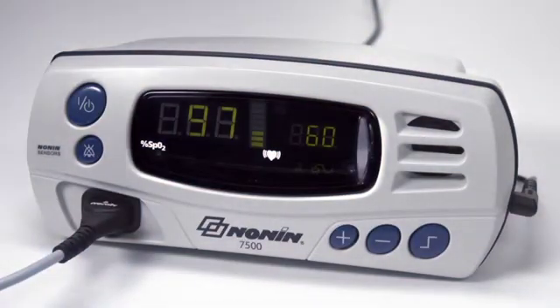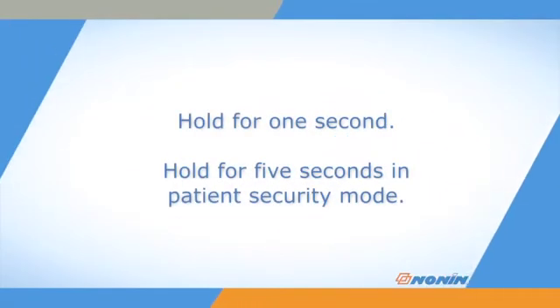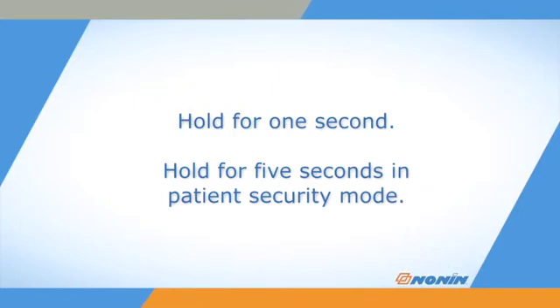When you are ready to stop using the oximeter, simply press and hold the on-off button until the oximeter turns off. Hold for 1 second in normal function and 5 seconds if the oximeter is in patient security mode. Then you can unplug and remove the sensor.